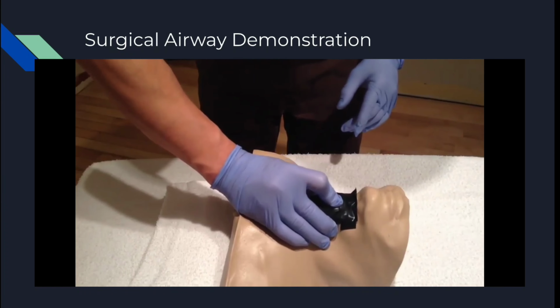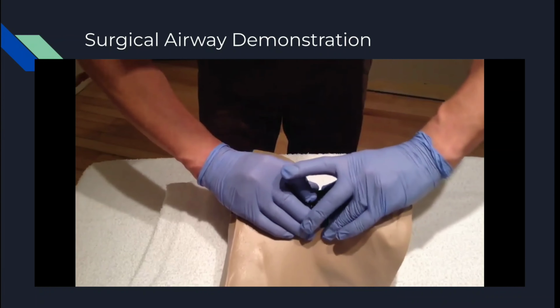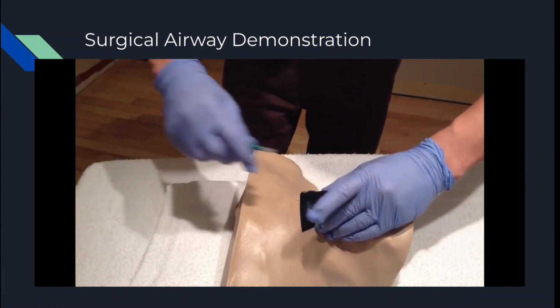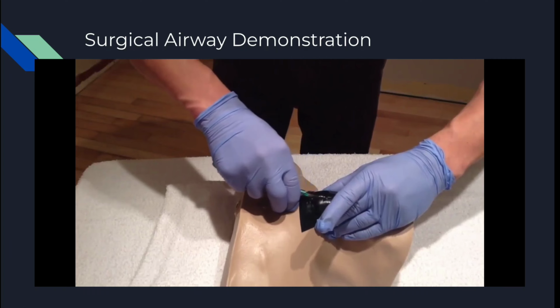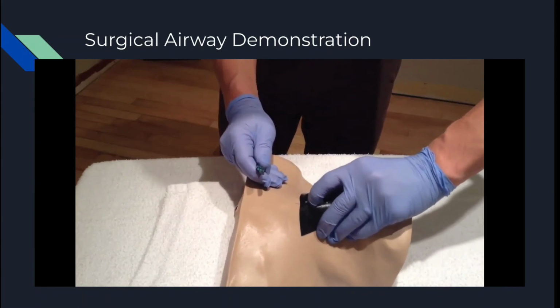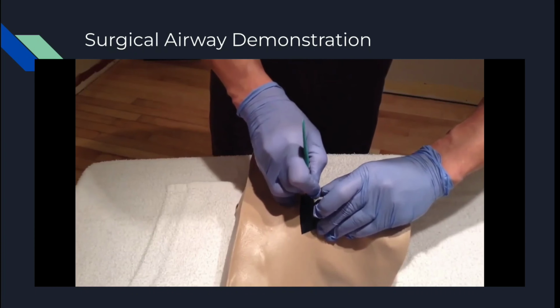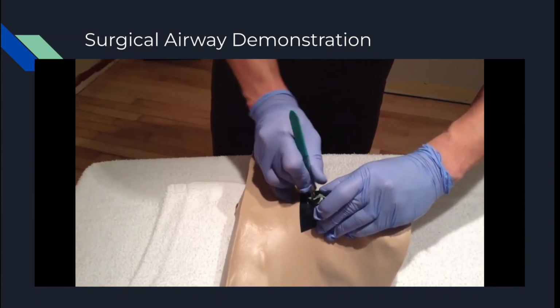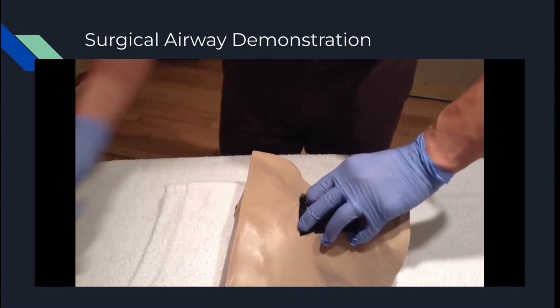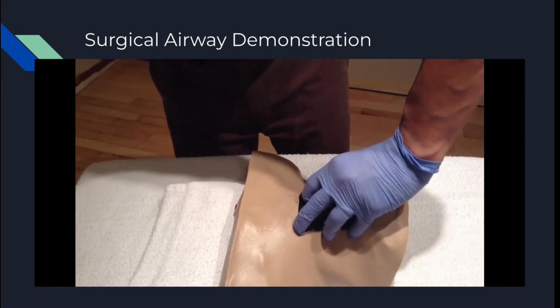Okay. Laryngeal handshake, midline. I can feel the thyroid, cricothyroid membranes right there. Left hand stabilizing the thyroid. I'm midline, scalpel cut. Feel the tissues through the subcutaneous cricothyroid there, inferior margin. Cutting left, cutting right. Vertical incision, and now he's making a horizontal incision. Confirming the hole, dilating it. Bougie, please.